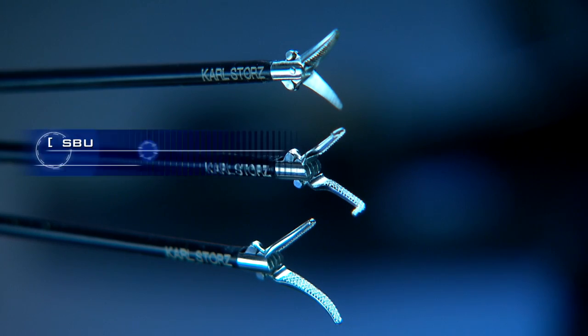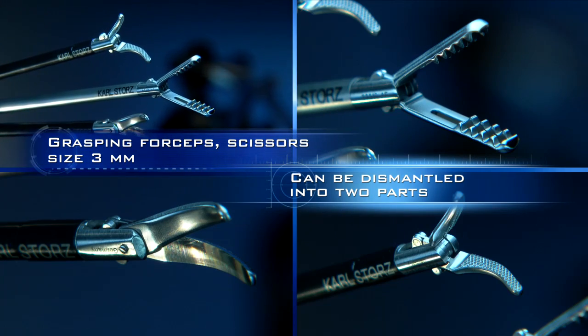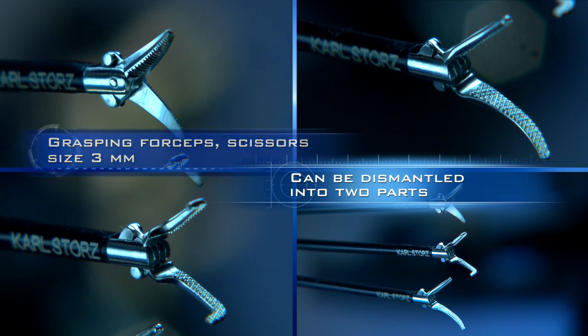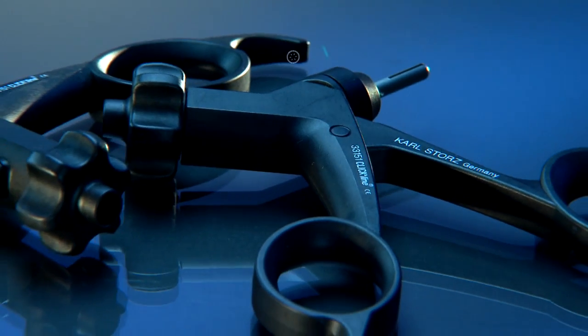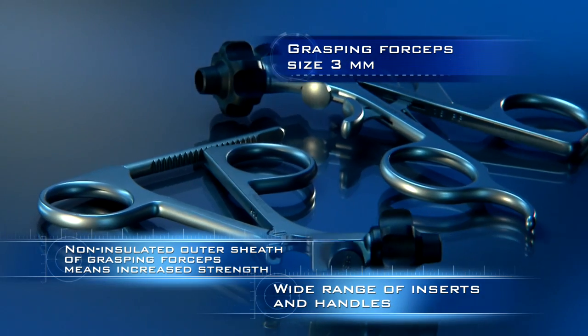Grasping forceps — either insulated for the application of HF current or without insulation. The grasping forceps with non-insulated outer sheath offer added strength.